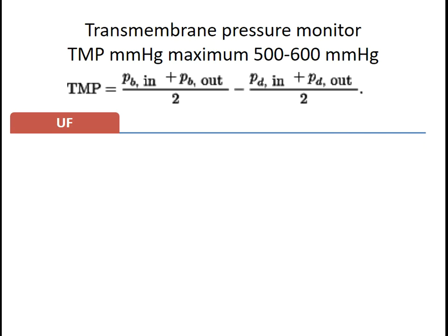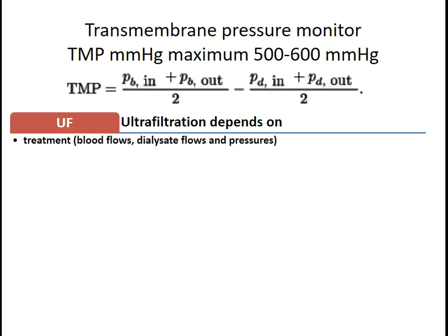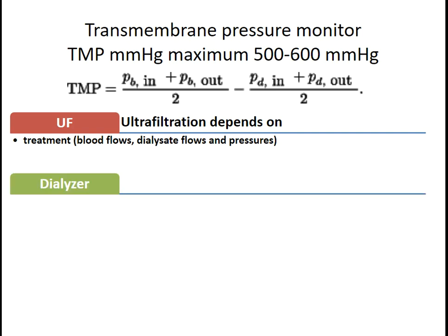Ultrafiltration depends on the treatment modality, the blood flow, the dialysate flow, and the pressures. The dialyzer specification.